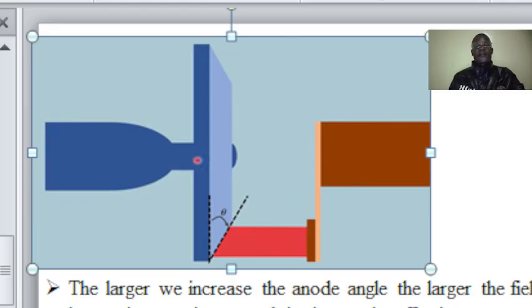Now, the vast majority of the energy of an electron, as we have said, actually 99%, is being converted to some other forms. We only use 1% to produce X-rays.